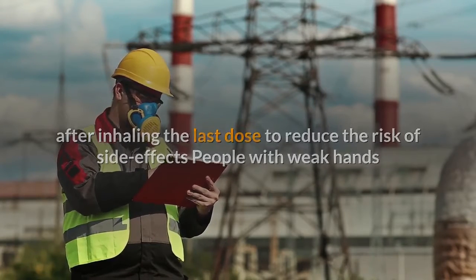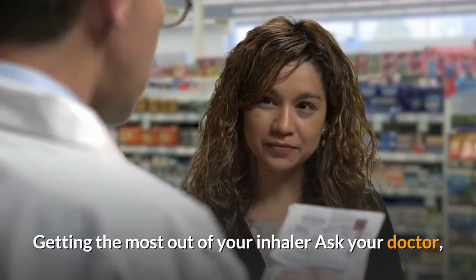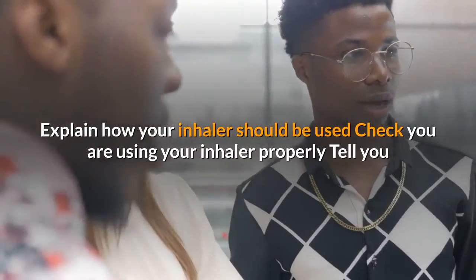People with weak hands or osteoarthritis who have difficulty using a standard inhaler should ask their pharmacist about a Haleraid device. Getting the most out of your inhaler: ask your doctor, pharmacist or asthma and respiratory educator to explain how your inhaler should be used.